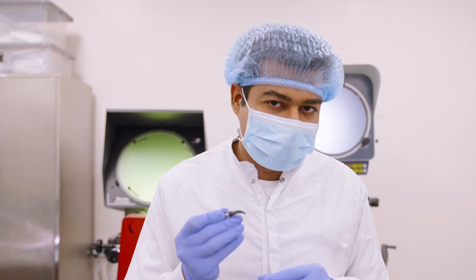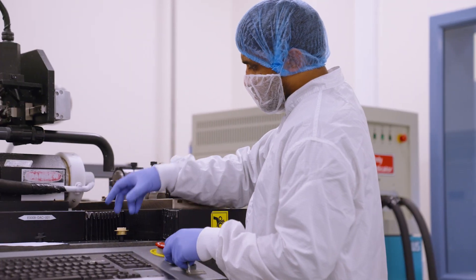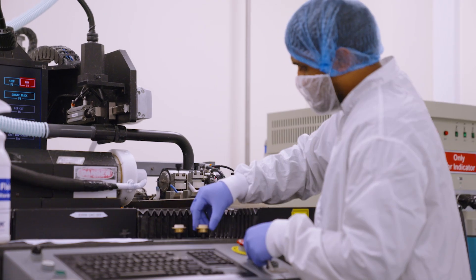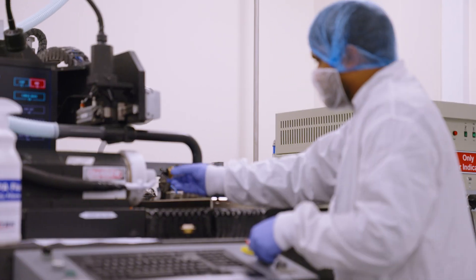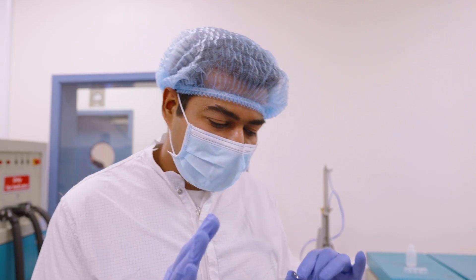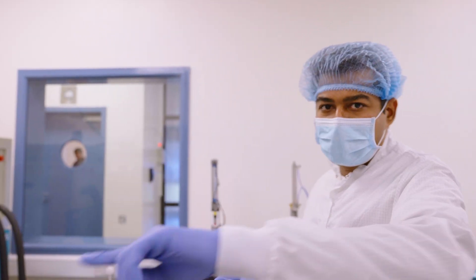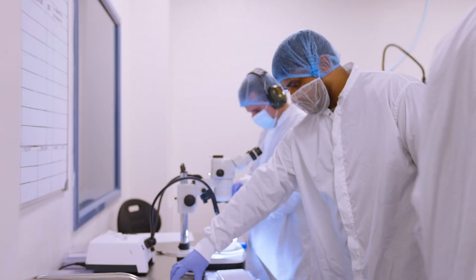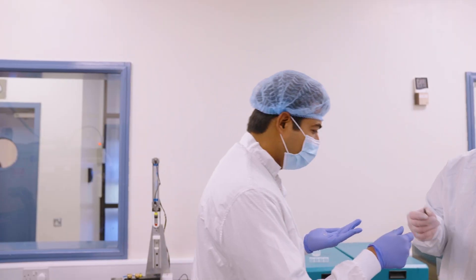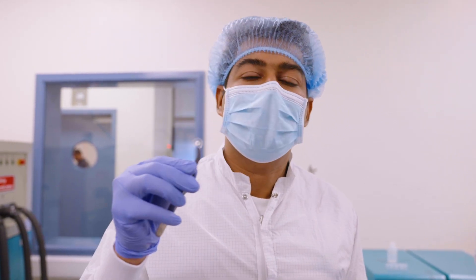Now I want to show you how this lens is manufactured. This entire process starts with a button — this button is the material from which the lens will be made. The first step in manufacturing is called lathing. In lathing, this machine carves into the button, and gives the button the first shape of the lens. When we put it into this machine, you can see how a lens shape is formed in the middle — this is how the first step is completed.